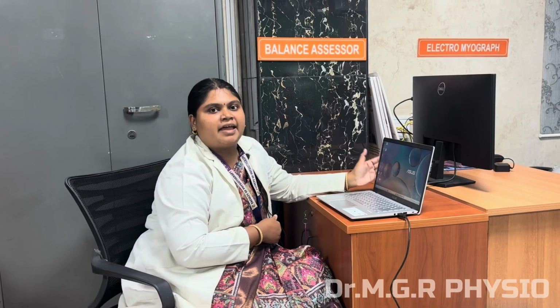This balance assessor is useful for research and patient assessment, and UG students, PG students and PhD scholars use it for their studies. It gives a reliable result for any study. Thank you.